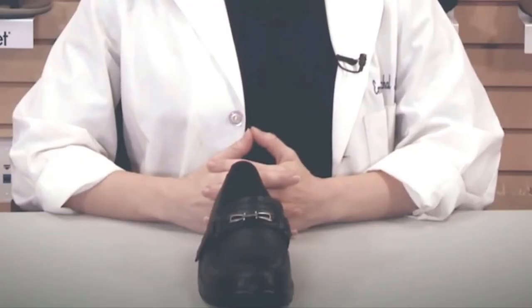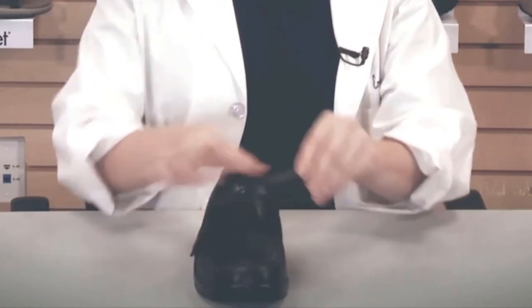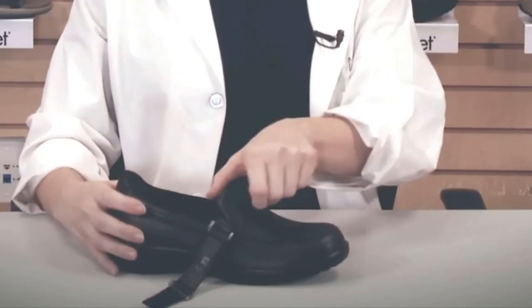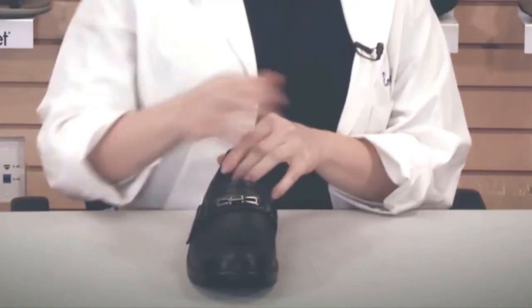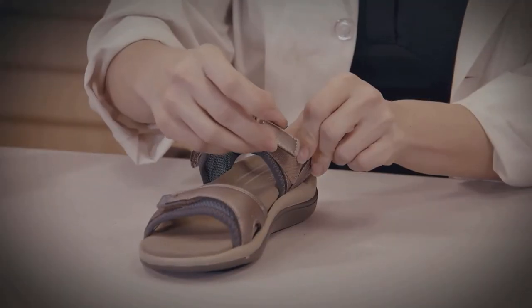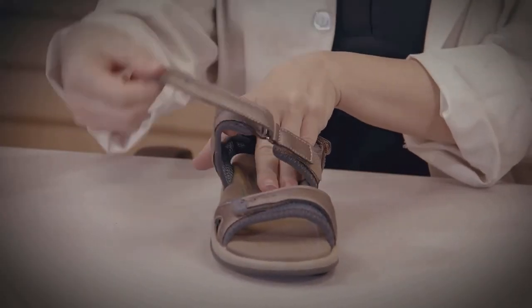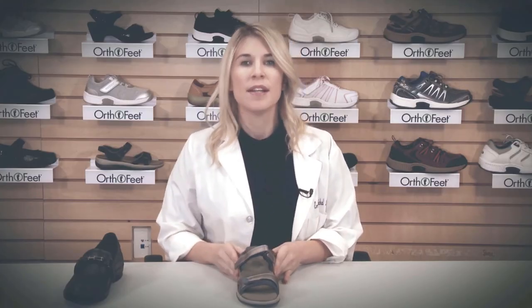Another feature of OrthoFeet shoes is the two-way strap system. This has Velcro fastenings on either side of the shoe, allowing for easy access and an easy slip-on design with a wide opening. The two-way strap system is also available in the sandals, which allows you to adjust the length of the strap. The advantage of the two-way strap system is that it allows you to access the shoe from either the inside or the outside, which is beneficial for those who have trouble reaching down or may have arthritis.